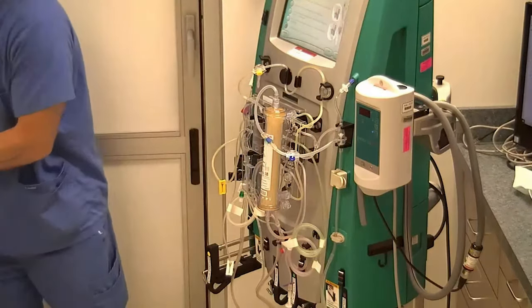So now we have both the red access line and the blue return line in one place on our priming bag. So when we go to connect to our patient, we can actually take this all together in one piece and lay it right beside our patient's catheter, whether it's in the neck area or in the groin. The machine wants you to do it step by step. Disconnect your Y, then connect your red, come back to the machine, get your blue. This way we're doing it all in one step, so we don't have to go back and forth between the machine and the patient.